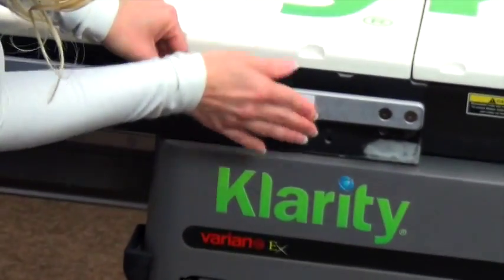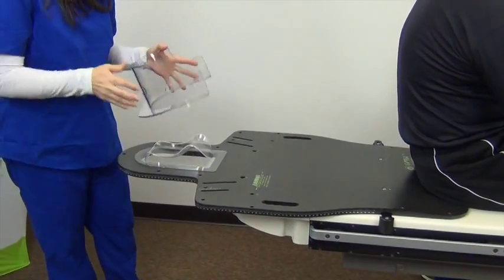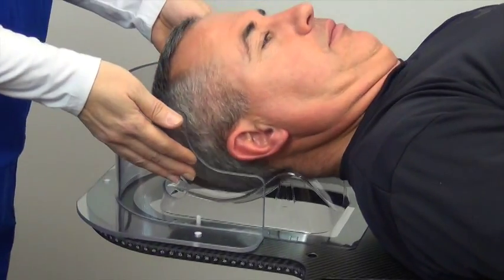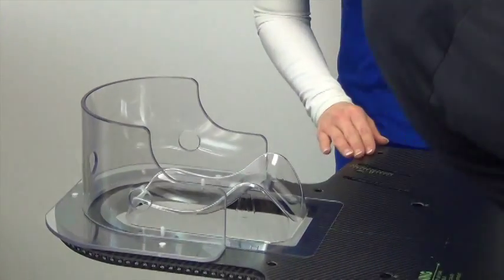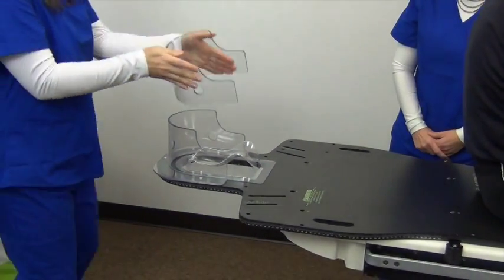Secure the Velcro strips to each side of your treatment couch. Attach the headrest to the overlay board and then place the outer shell mold around the headrest. Have your patient lie down so their head rests comfortably. Their shoulders should line up where the mask will eventually attach to the board.